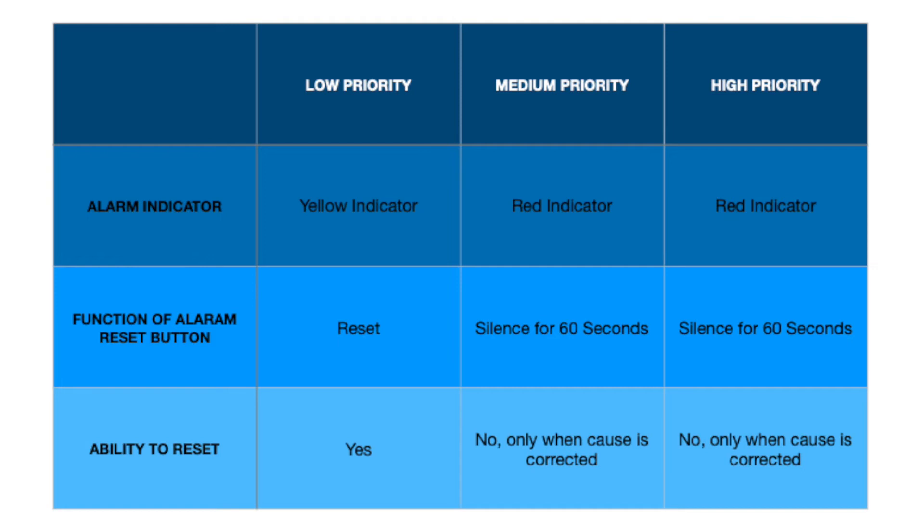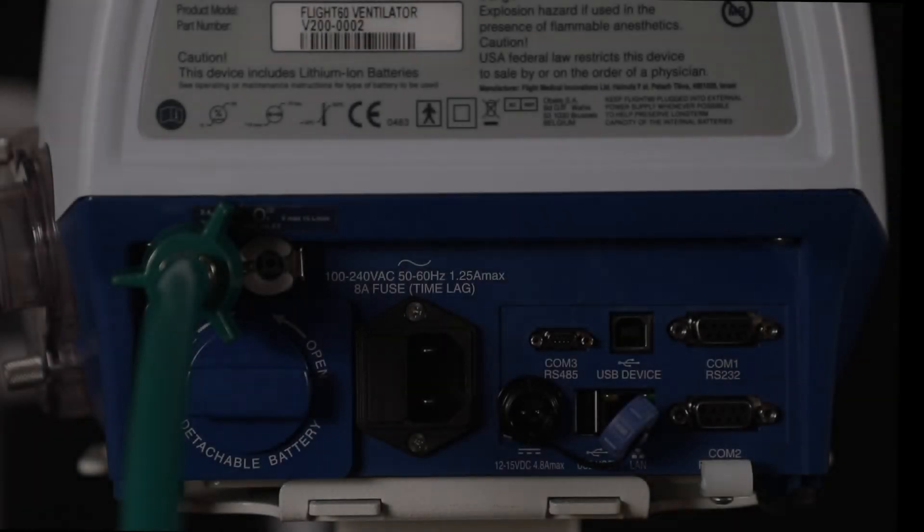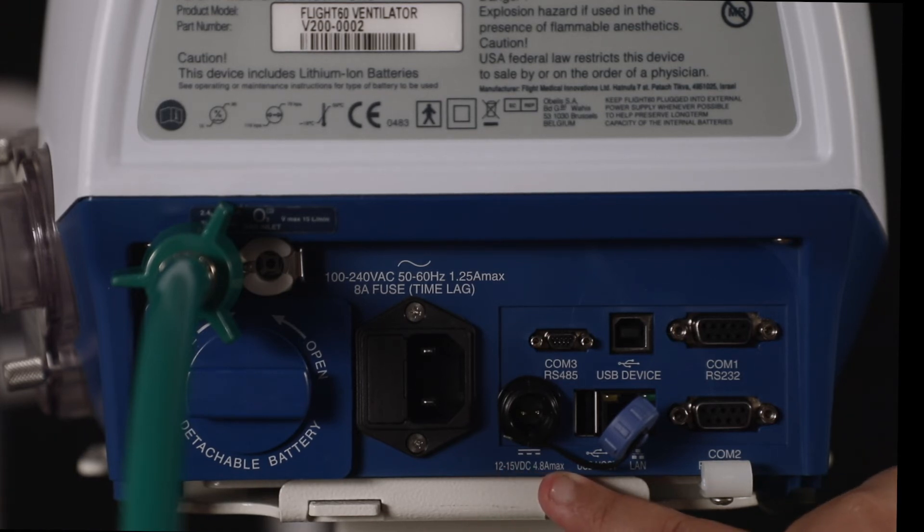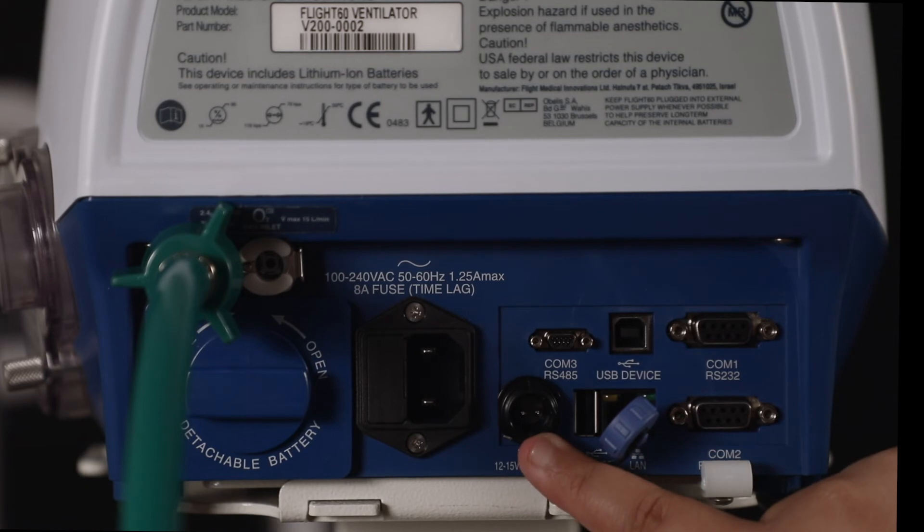When the combined charge of both batteries is less than 10%, or the integral battery is less than 5%, an empty battery alarm is activated. This alarm can be silenced for 60 seconds but cannot be reset by the user. The DC input is 12 to 15 VDC at 4.8 amps max, which enables use of the machine even in a car.